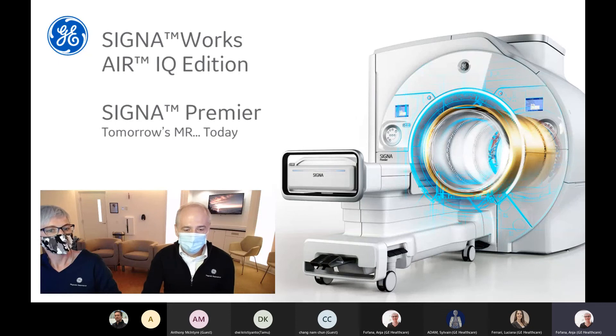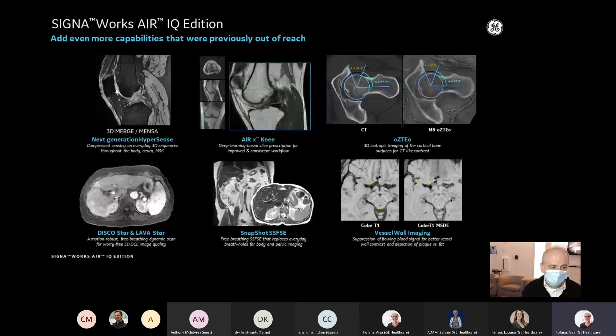Before we get started into the scanning, we wanted to highlight some of the features in CignaWorks AIR IQ Edition. This software release has quite a few new features. We've extended the capabilities of adding Hypersense to 3D gradient echo imaging, which is really helpful for merge imaging, gradient echo, and Mensa. Those applications will benefit from Hypersense to reduce scan time and improve spatial resolutions. We've also expanded artificial intelligence on our system.